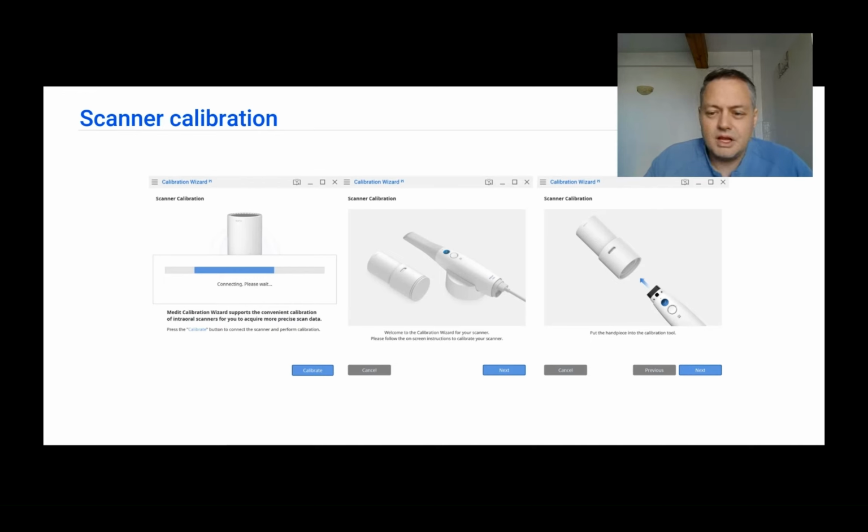And also you are going to get a pop-up message sometimes telling you that the scanner is not warm enough. This is very important, because physical objects have dimensions varying by their temperatures. Let the scanner heat accordingly before using it for calibration, but also for general use. Never start scanning if the scanner is not warm enough. Let it do its thing, and only after everything is warm enough and it tells you that this is done, only then can you start scanning.